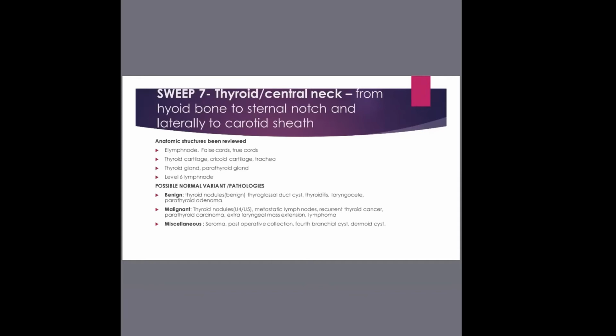Now, sometimes you see people with swelling here at the sternal angle. That swelling is not necessarily thyroid nodules. The sternoclavicular joint sometimes does have degeneration. For those of you who do MSK, I'm sure you know what I'm talking about. And when it's degenerated, it appears so swollen that you think, oh, there's a lump there.